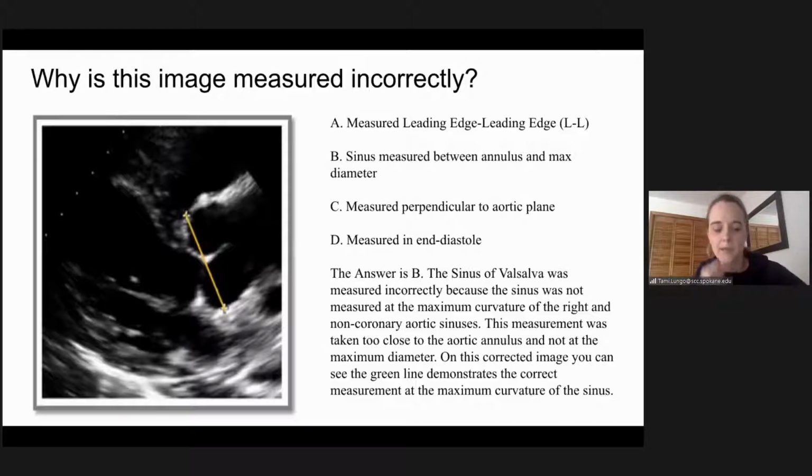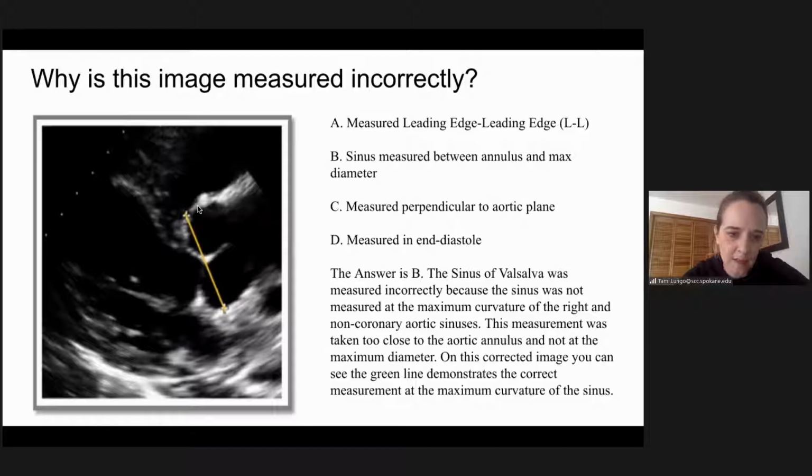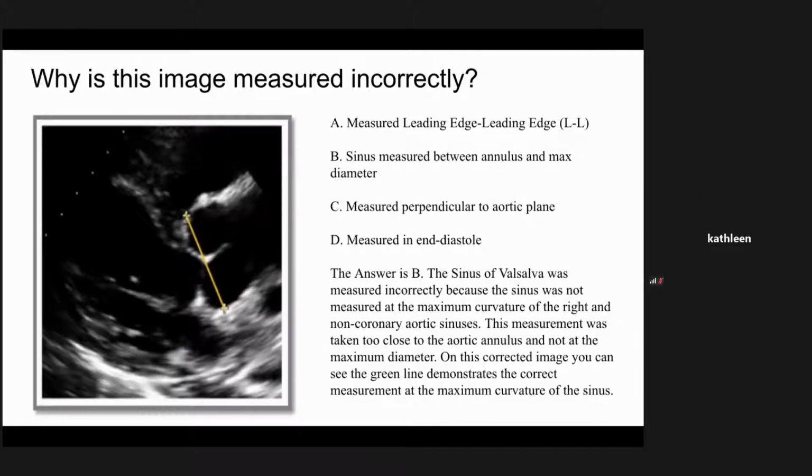Okay. Tammy, on this one, would it just be the top caliper that you would move over? Because the bottom one looks like it's probably in the correct spot. Yeah, so if I take a pencil like this, I would take the top one for sure, definitely. And then, yeah, probably just that top one. The next slide will show the correct placement, Kathleen.